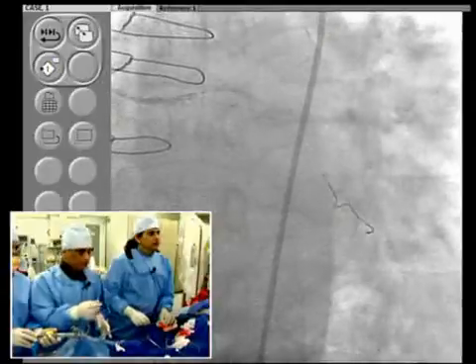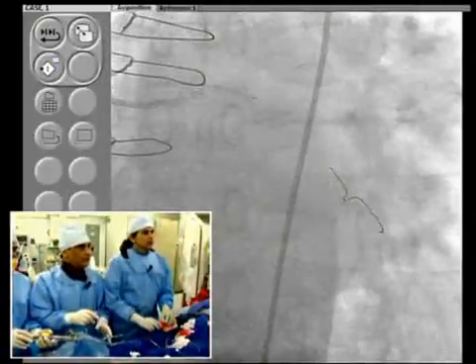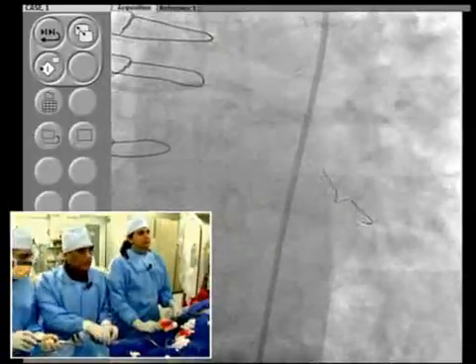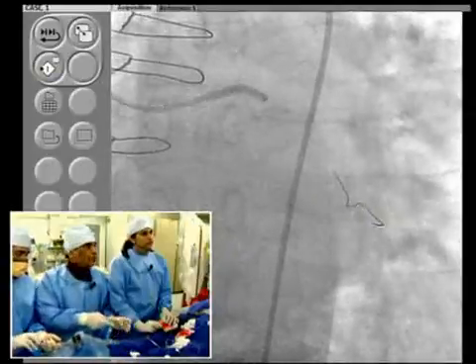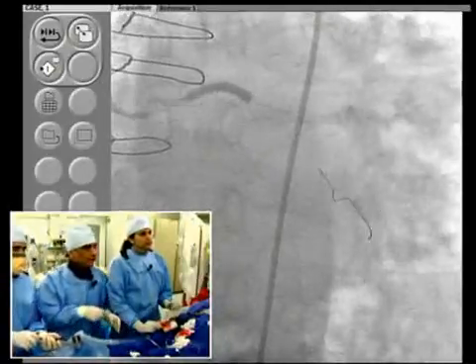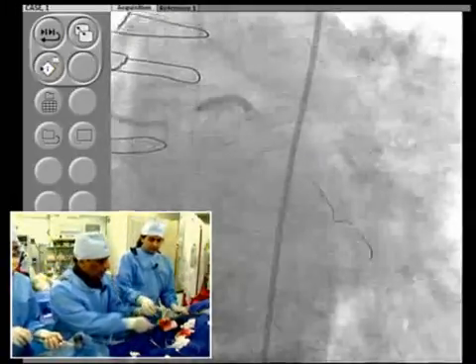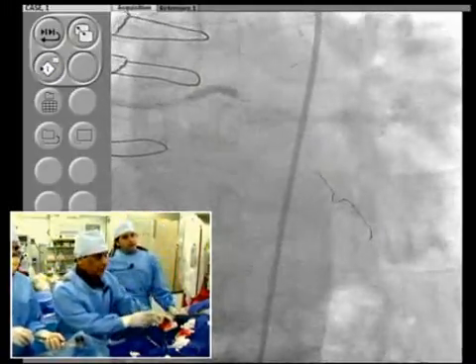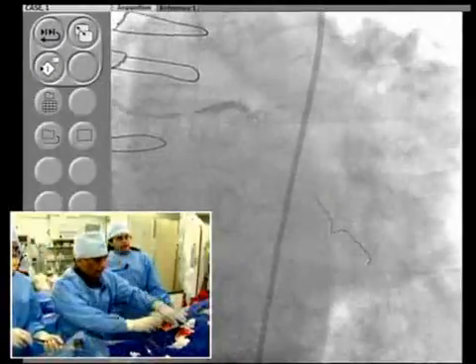Is this a new balloon you have or a used one? Yeah, this is the new balloon. Okay, there it goes. The left main and the proximal circ look very good, even there with just 3.0. So this is a 3.5 now. This is 3.5, 16 atmospheres, and then we are going to bring it to the ostium, knowing that the ostial will be the important part when the patient comes back for part 2.